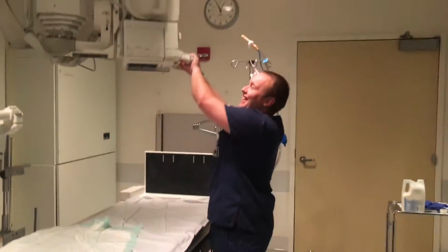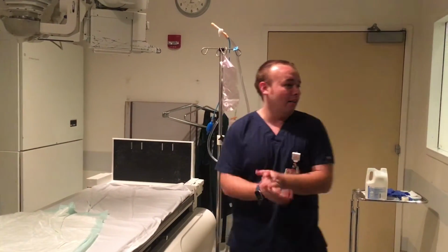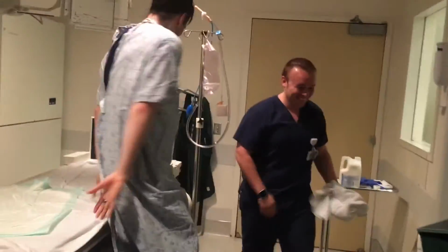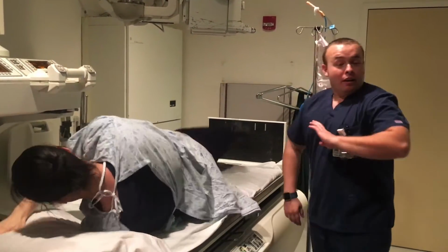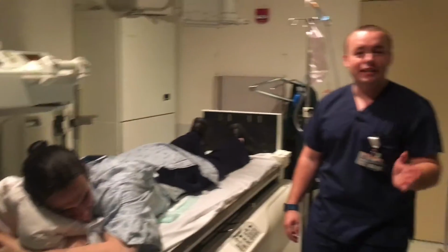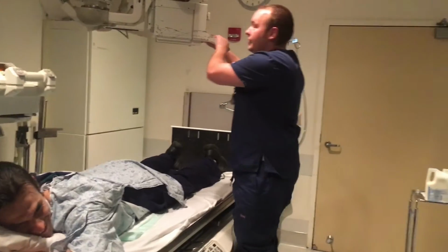Alright, camera back over here. Oh my God. So while we're waiting, oh, that was fast. Alright, he's back. Come on over. Oh! Alright, you're going to have to actually flip around there. Did you evacuate? Alright, patient has evacuated the barium. We're going to do another picture and see if he's telling the truth.